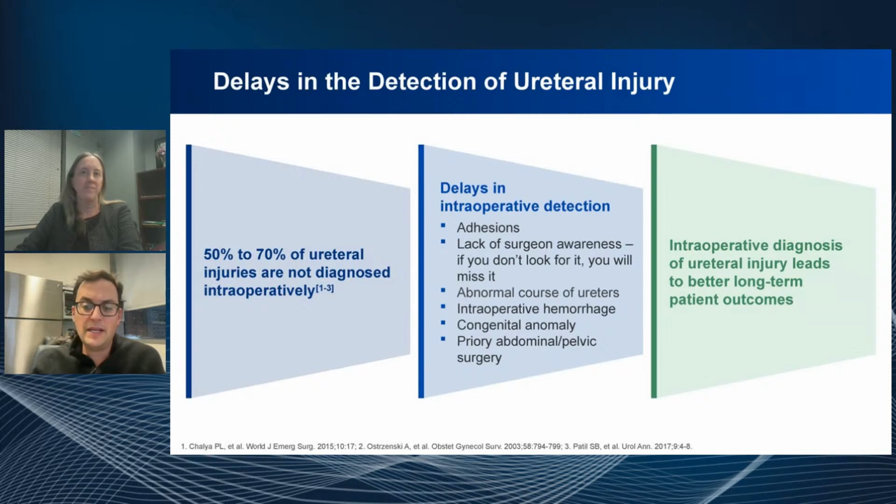There are things that can make it difficult to detect. So, for example, things like adhesion. There is a little bit, you were saying, being humble. If you think, well, the ureter is not there and I'm not going to look for it. I know today doing cases, probably 7 times I looked at the same ureter just because I wanted to make sure that I saw and knew where it was. And still at the end of the case, I checked patency.